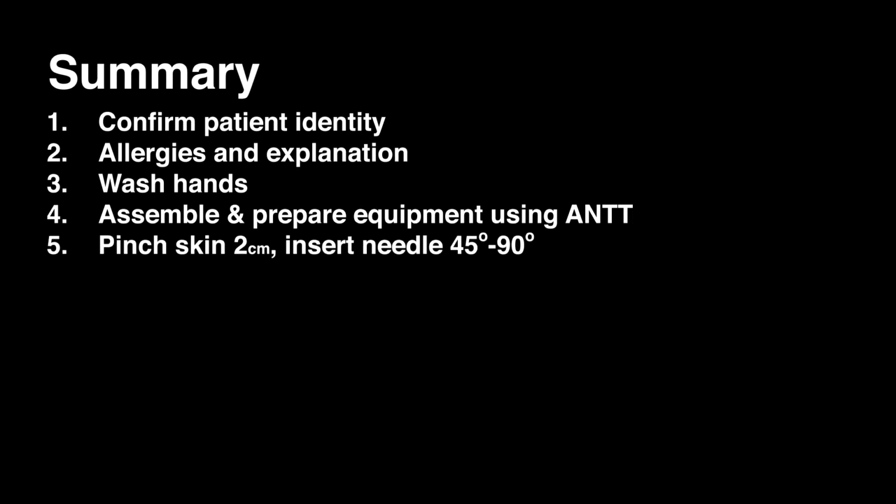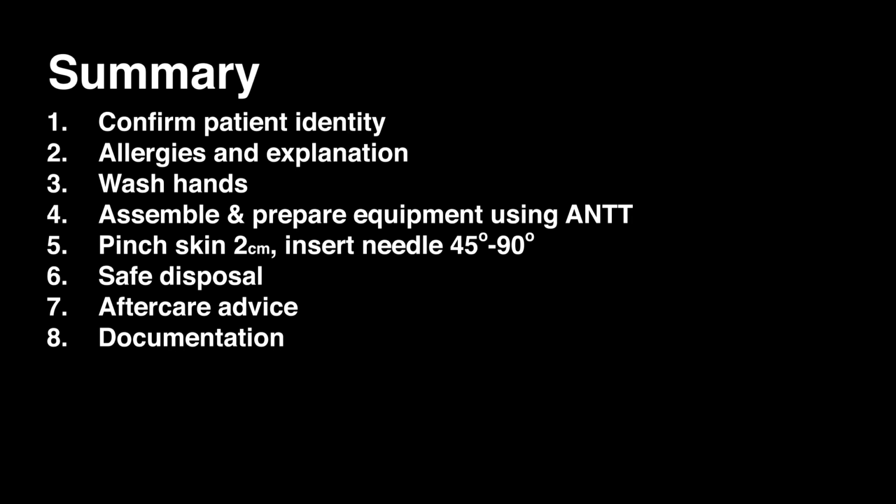Pinch the skin upwards, about 2 centimeters of the skin, and insert the needle 45 to 90 degrees, dependent on the size of the needle and the patient. Ensure that sharps and equipment is disposed of safely, that adequate aftercare advice is provided, and the correct documentation is filled out.